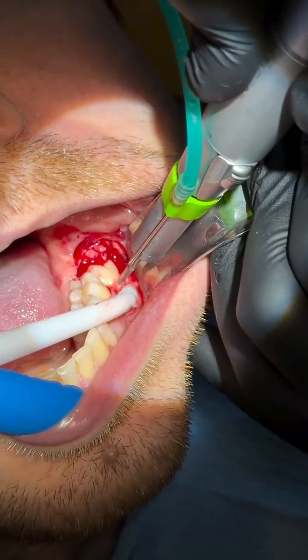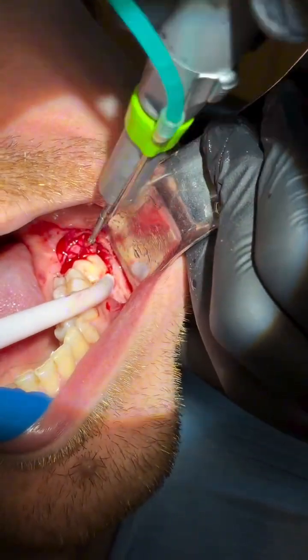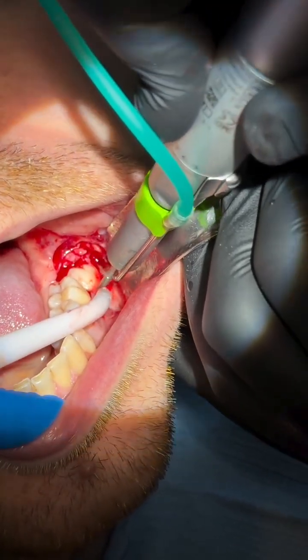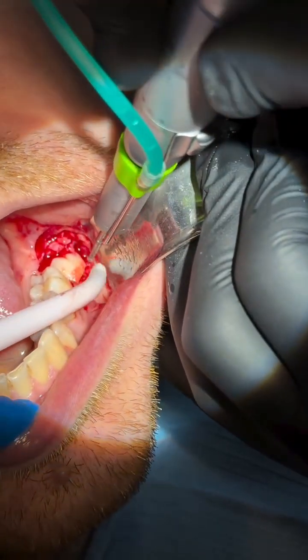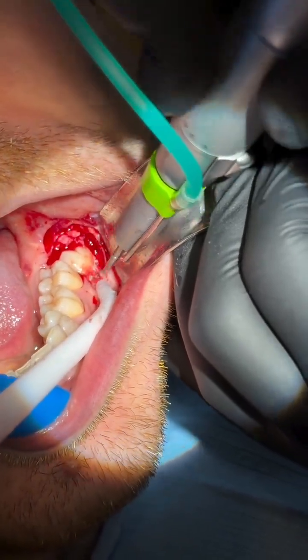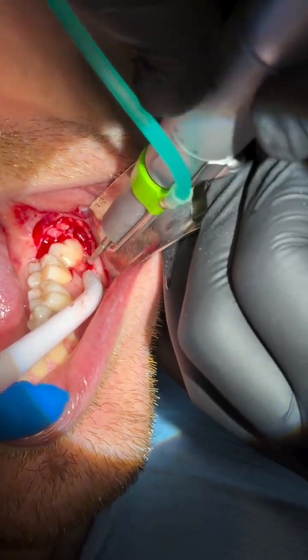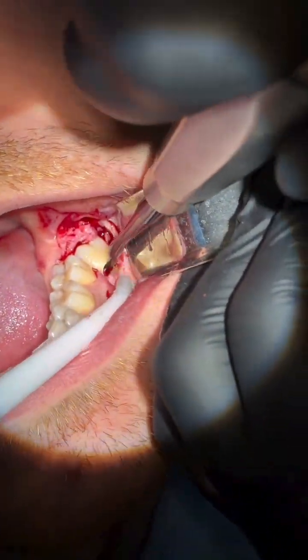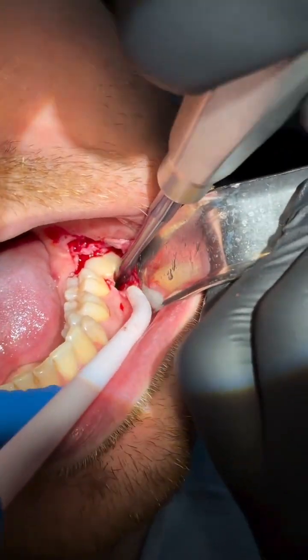Once I visualize the furcation, I use the same burr to make a cut just below the cementoenamel junction. I'm using the rose head burr, but you can use the Fisher burr. And the idea is to cut deep enough to section all the crown without going too deep lingually, as that can cause damage to the nerve. Once the cut is made, I use the luxator to break the crown off very carefully.